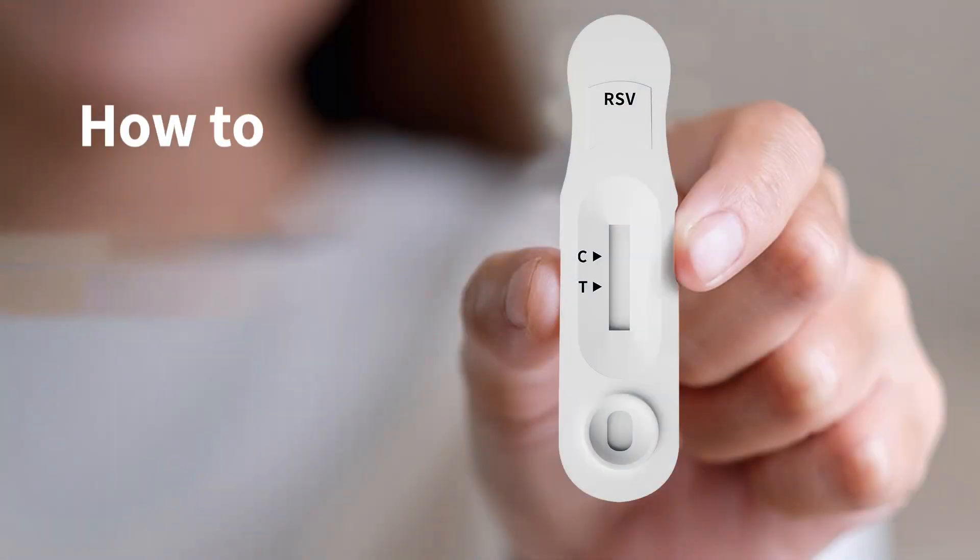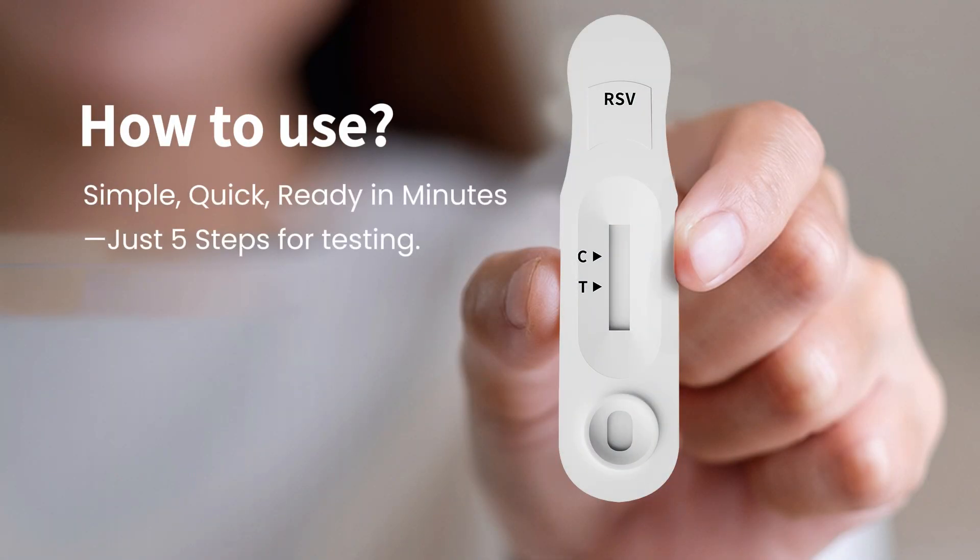The CoreDX TyFast RSV Rapid Test is simple to use. Just collect an anterior nasal swab sample and get clear, reliable results in just 15 minutes.